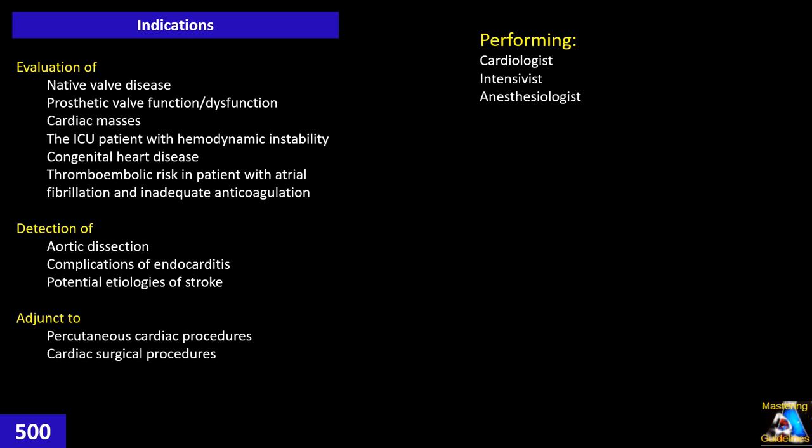TEE can be performed by three categories of specialists. One of them is the cardiologist, who focuses on the heart. Then the intensivist, usually in those cases where the patient in the ICU is hemodynamically unstable, and for ruling out dissection or other important pathology around the thorax, mediastinum, pulmonary embolism and others, we do TEE. Or finally, the anesthesiologist. All three of them can do and learn to do TEE.